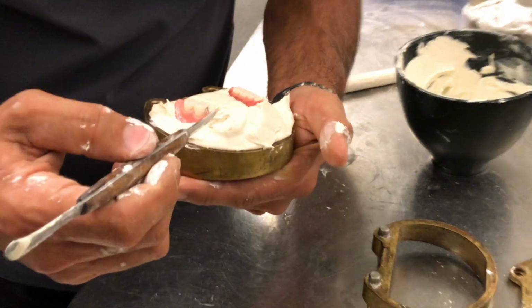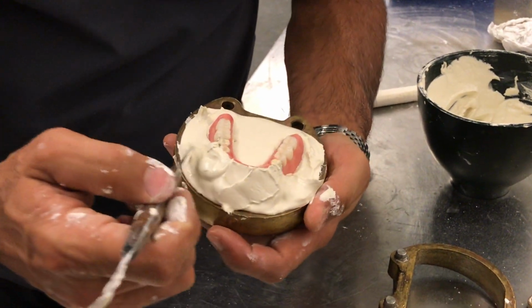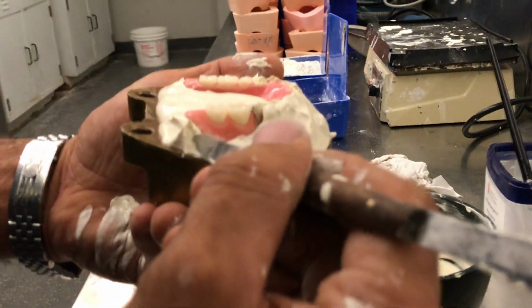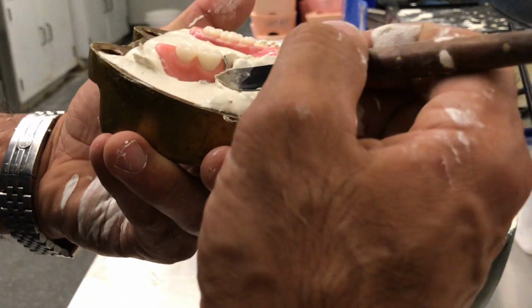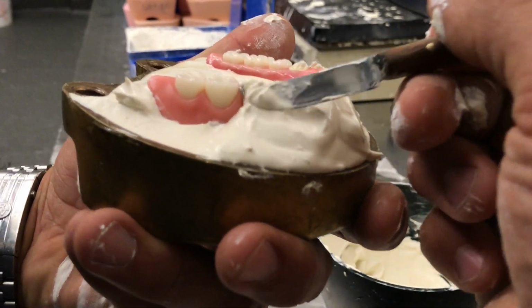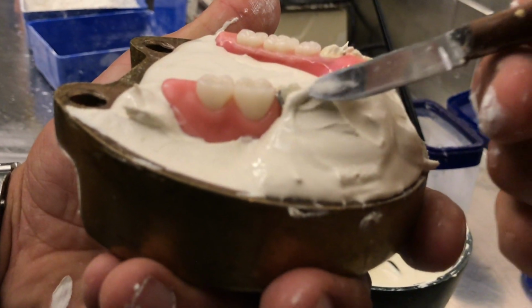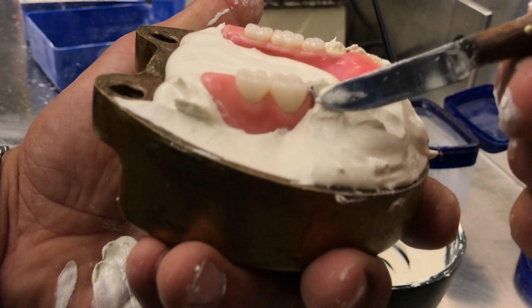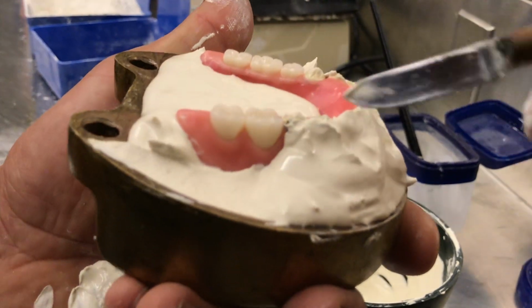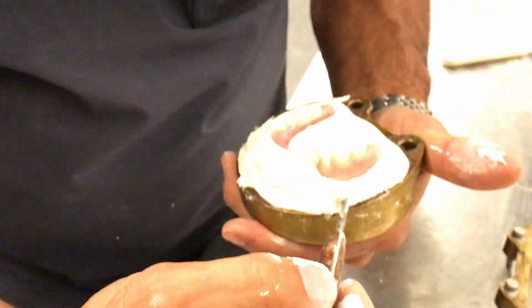Block out all of the facial undercuts on the model. And this is the area of concern right in here. I want to make sure that I put plaster stone mix between my little retentive tag, acrylic retentive tag, and the wax-up itself, and cover the rest of the wire as much as possible, like so. I'll go back and reshape that in a bit, and I'll do the same thing on this side.